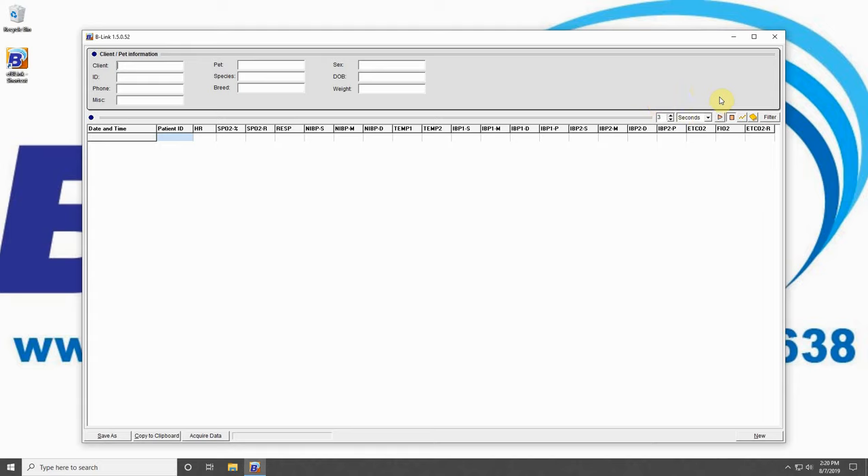This ensures you do not have to wait long for results to appear on screen. With that complete, hit the triangle button to begin recording data. When you see data being displayed, you have fully connected your BM1 VET to your B-Link software. Congratulations!